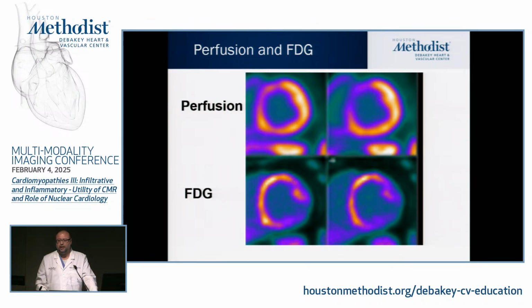So we're not trying to image the myocardium. The normal myocardial cells should take the perfusion agent, and we will image them with perfusion agents. But what we want is for these normal cells not to take up FDG. And many of you are eating right now, so your insulin level went up. When your insulin level goes up, your myocytes are just going to take up glucose. So if you get FDG, your heart is going to light up. So how do we do it? Opposite to what you are doing.